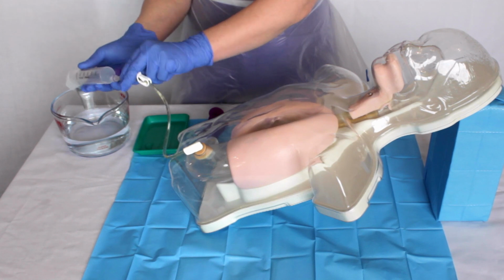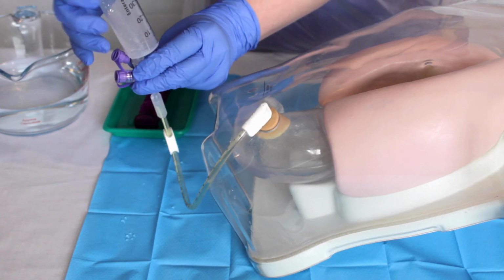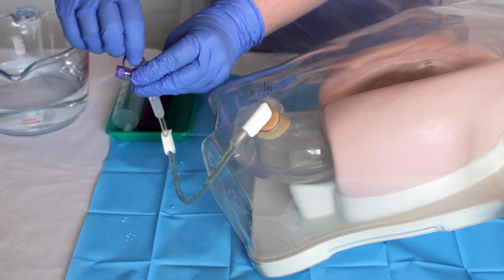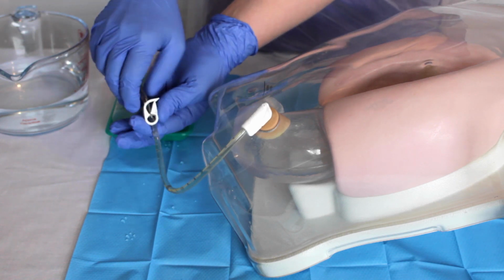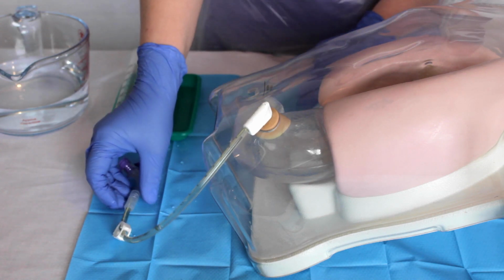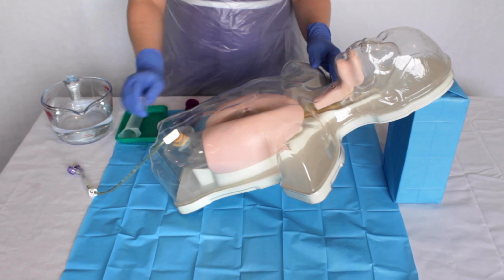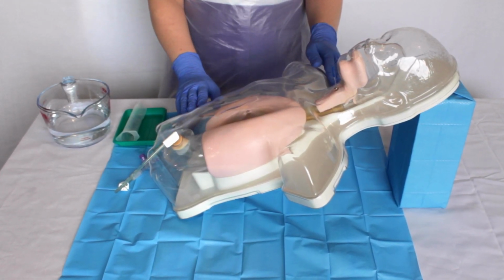Pour any remaining water in the syringe away and remove the syringe from the tube. Ensure to close the feeding cap. Wash and store syringes as per manufacturer's guidelines and ensure the patient remains in the position of at least 30 to 45 degrees for 1 hour post-tube flush in order to prevent aspiration.